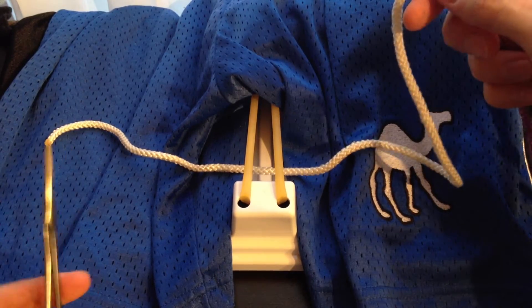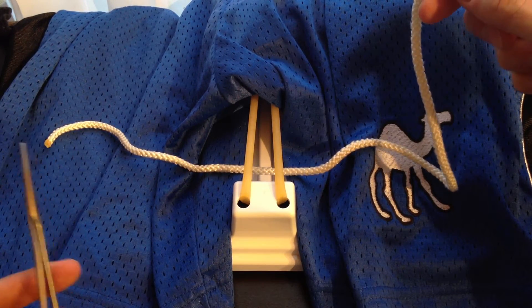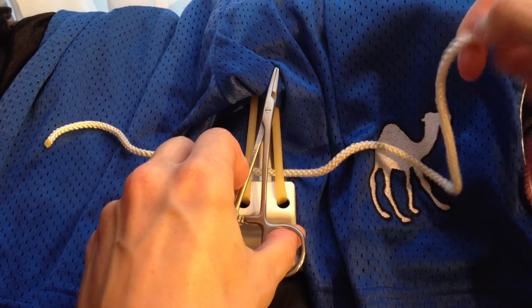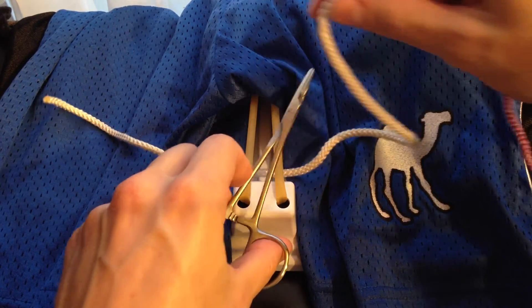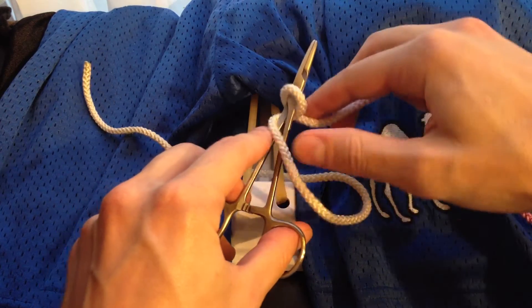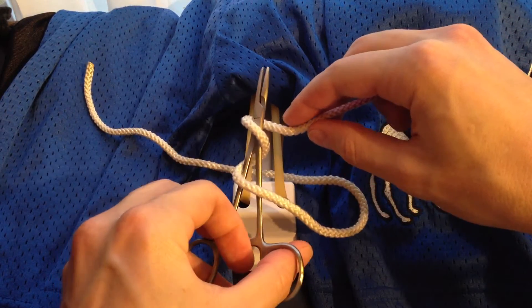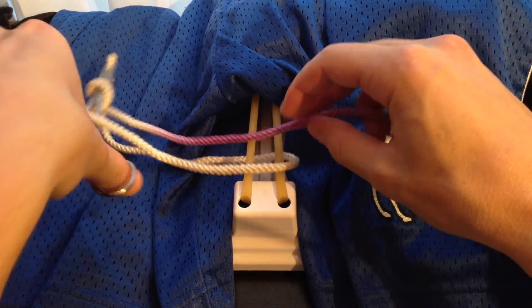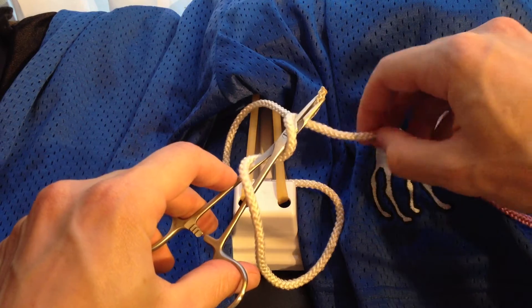When you pull this through, you want to pull your thread most of the way through, just leaving yourself a short tail on the left side to work with. You're going to hold the long side with your right hand. To start with all of these knots, you're going to put your instrument right on top of the incision. You're going to take the longer end and loop it twice around the needle driver. Next, you're going to grab the free end as close to the tip as you can — this makes it easier to pull through the loops you just created.